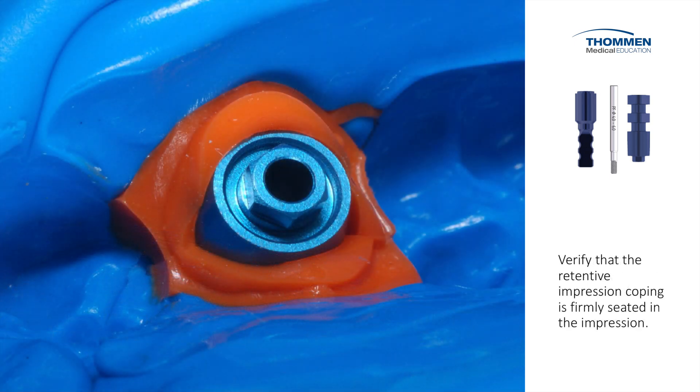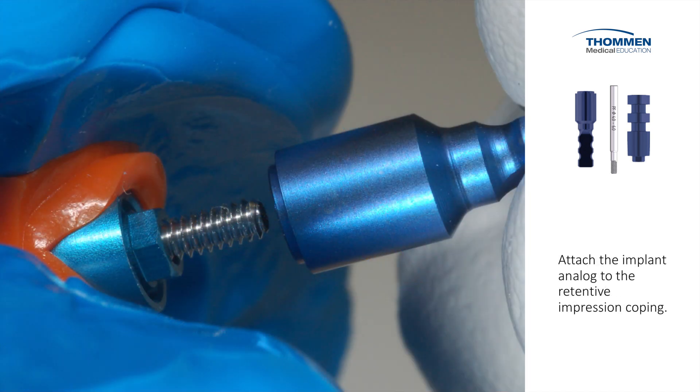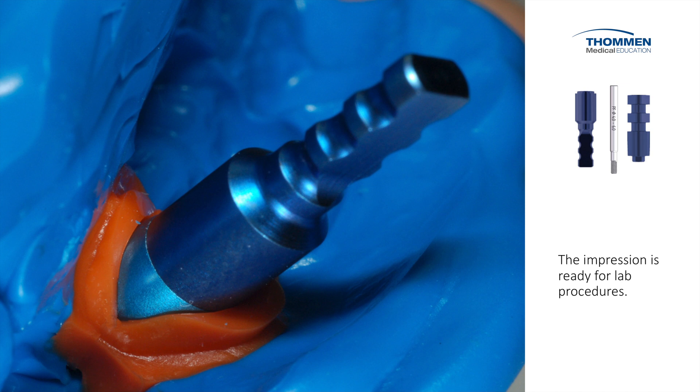We verify that the Retentive Impression Coping is firmly seated in the impression and is not moving or rotating. We then attach the implant analog. Remember, the analog will serve in the model as the location of the implant. We tighten the impression screw and the impression is ready for laboratory procedures.